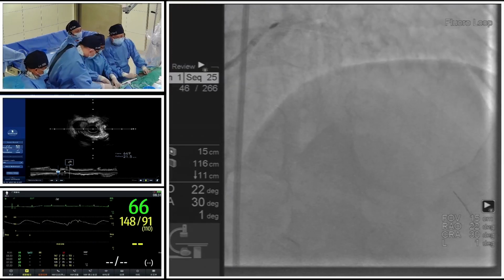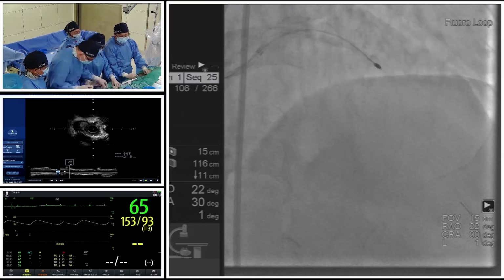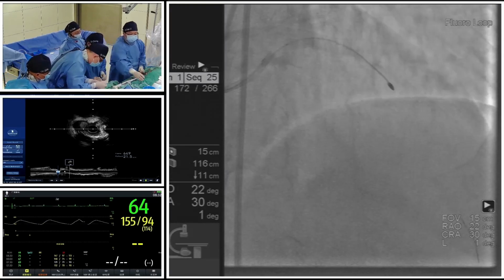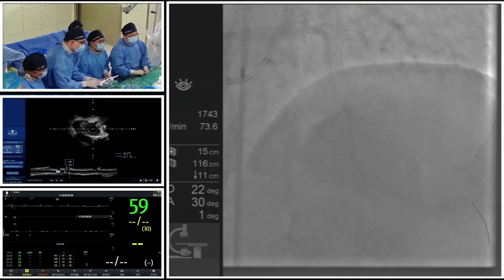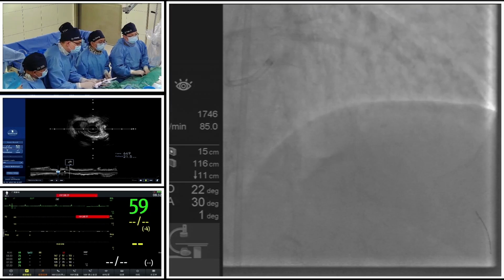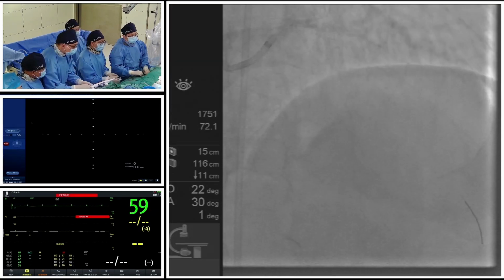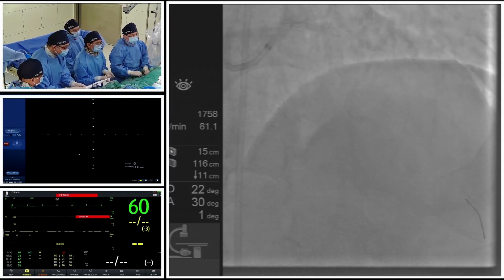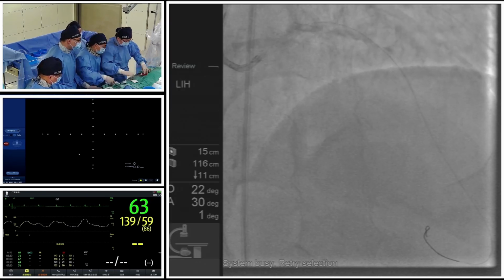We usually use several intracoronary injection medications for the slow flow phenomenon. For example, nitroprusside and nitroglycerin, of course. We can see that we withdraw the rotablation burr at a low speed. This is the most quick and effective way to withdraw the rotablation burr.